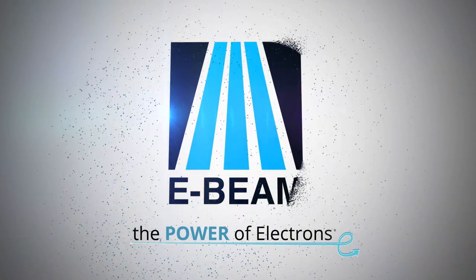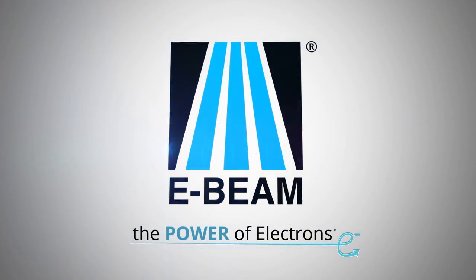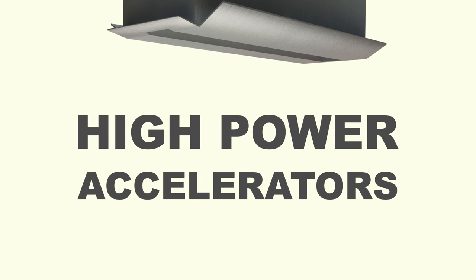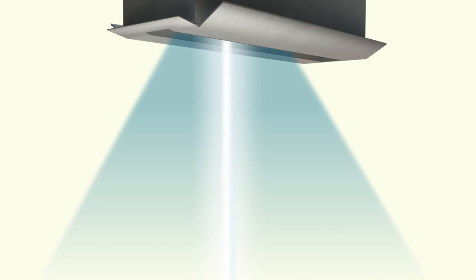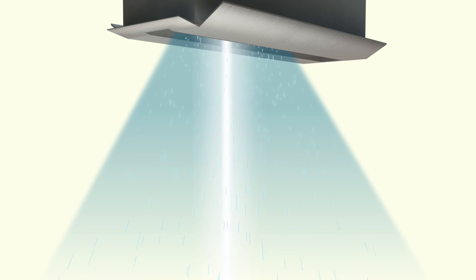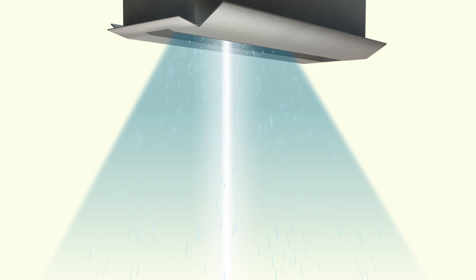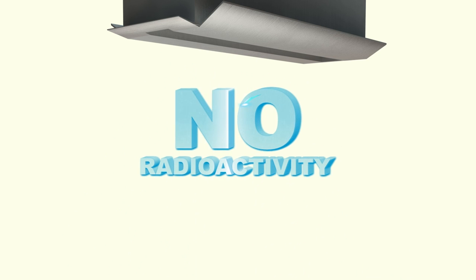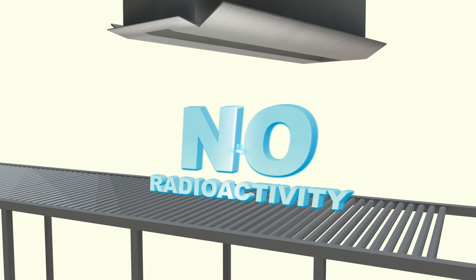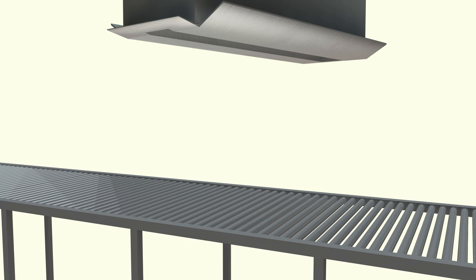The electron beam sterilization process begins with an electron beam accelerator. E-beam services uses high-power state-of-the-art accelerators to create a powerful beam of electrons. The beam is scanned back and forth to create a curtain of fast electrons, which shower and safely ionize the materials that they strike. There is no radioactivity involved in electron beam sterilization.